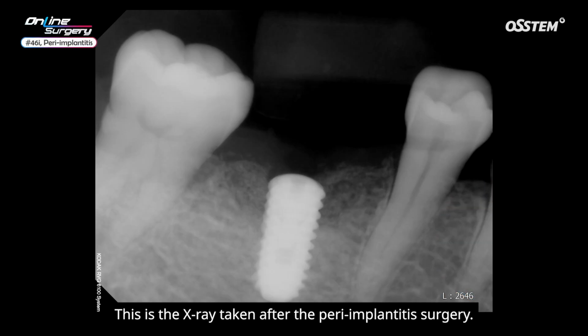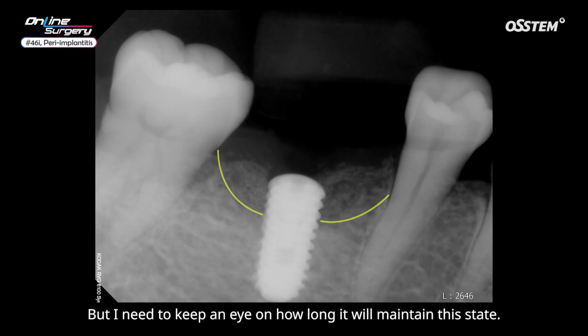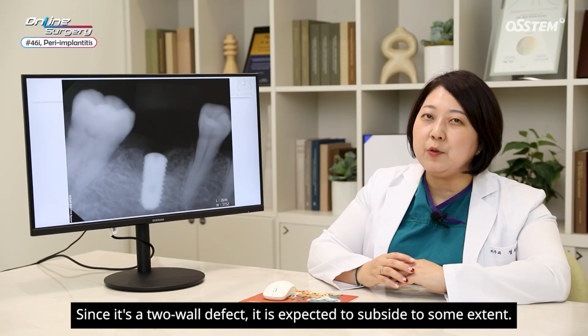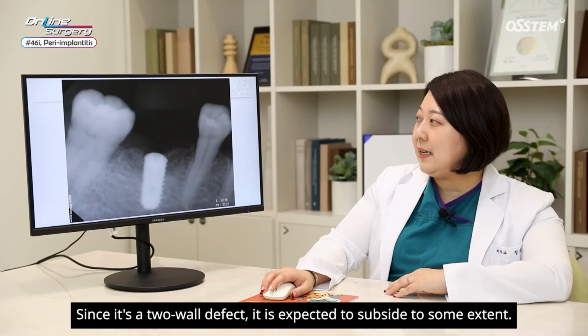This is the X-ray taken after the peri-implantitis surgery. In the photo, you can see the defect is filled in well with the grafted material. But I need to keep an eye on how long it will maintain this state. Since it's a two-wall defect, it is expected to subside to some extent.